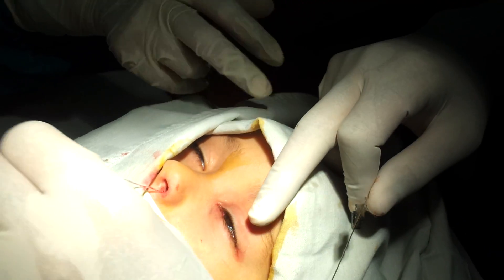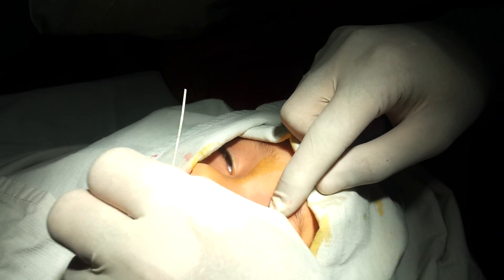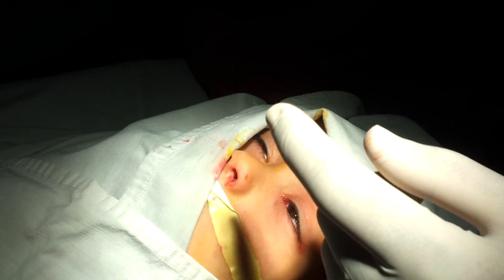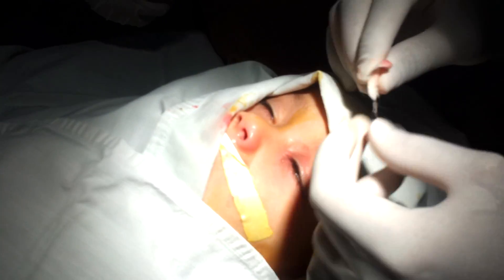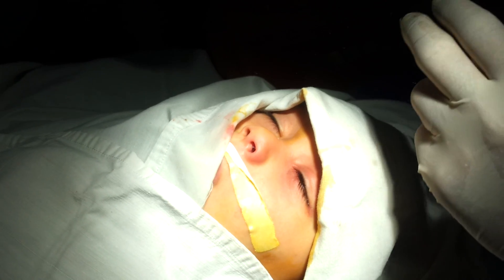You pull it out and now you have the knot in the sac. For extraction it's very easy — you pull it out, put one side, and the knot comes out. This is the easiest way to take it out; you don't need general anesthesia. Cut the tube here. You have to tell the parents that they might see a silicone tube protruding from the patient's nose — ensure them that this is fine, nothing to worry about. Some spotting of drops of blood is absolutely acceptable, no problem. And we're done — this patient is fully intubated. Thank you.